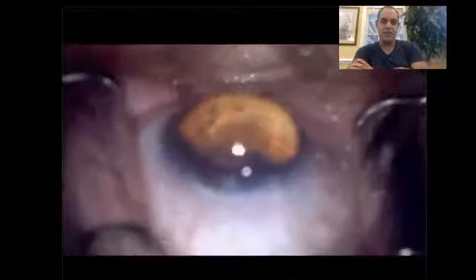So what I did here is I injected viscoelastic in the anterior chamber to basically pressurize the anterior chamber, and then I put Viscoat on the cornea. We're going to use that to couple the lens. And here what I'm doing is rotating the scope while my assistant is basically cutting the tape that's holding the patient's head in place. I rotate the patient's head away from me, and I rotate the microscope.